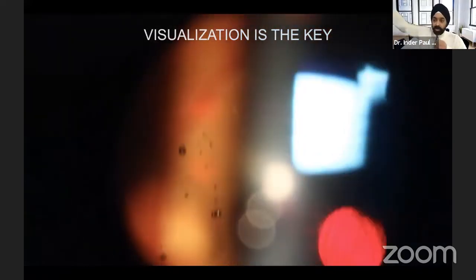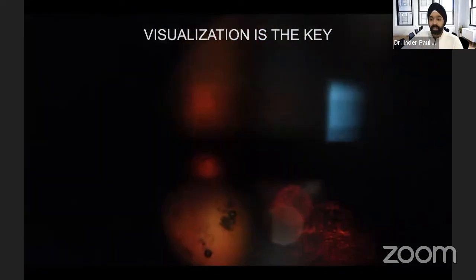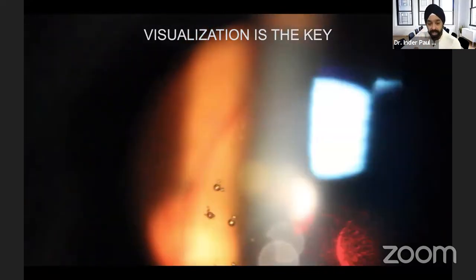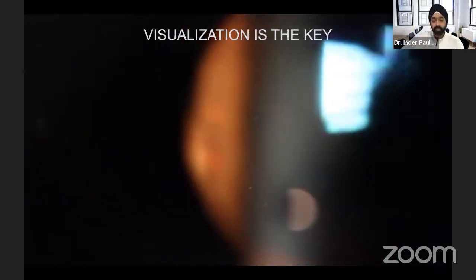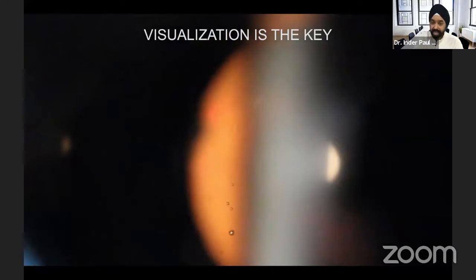But you see here, we're breaking it up and vaporizing. And number two, because of the energy delivery, we're not seeing this floater shooting everywhere. There's not a lot of disruption of the vitreous because of the energy delivery being so consistent as well as efficient. We're not seeing the scattering of the floater as well. So this is just an example of what it looks like to us, but the visualization is crucial.